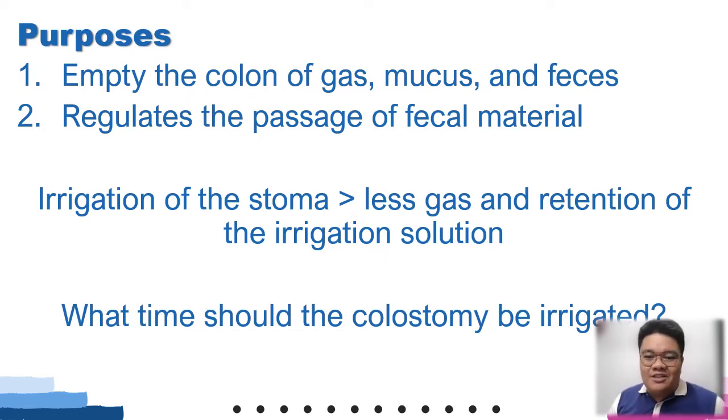Now, for that reason, we are doing your irrigation. But take note, nurses, usually in our setting, irrigation is done by physicians. In training hospitals, it is usually the residents who are doing it. So class, in our role as nurses, you only perform the irrigation if it is ordered by the doctor.